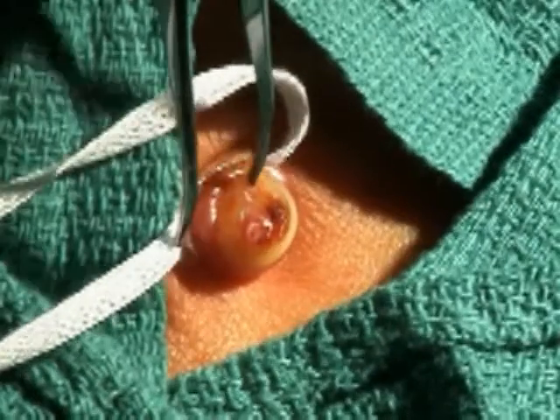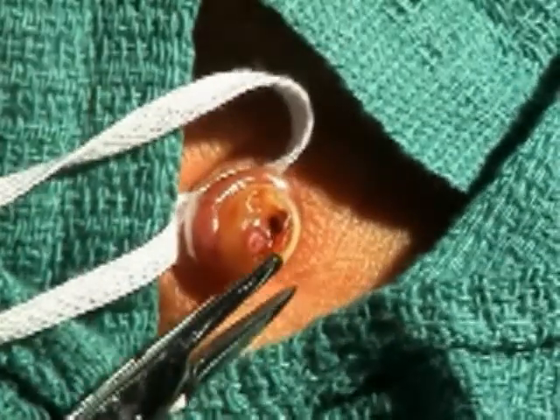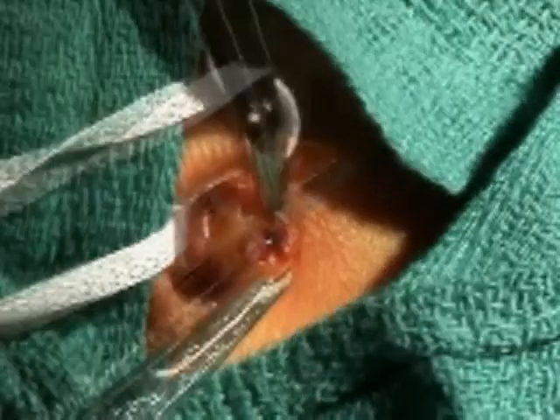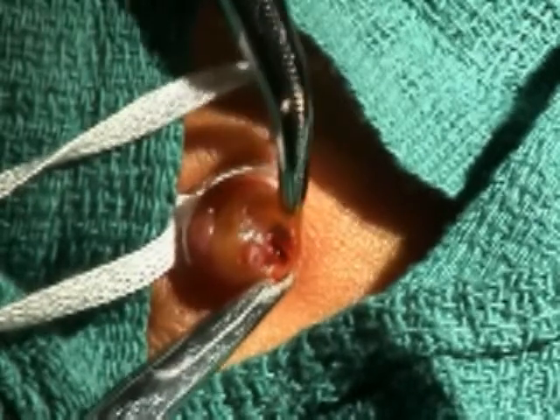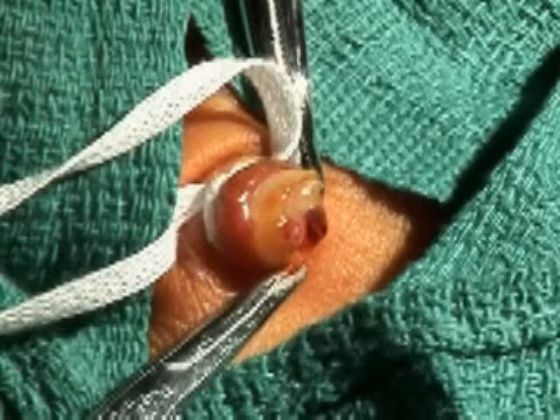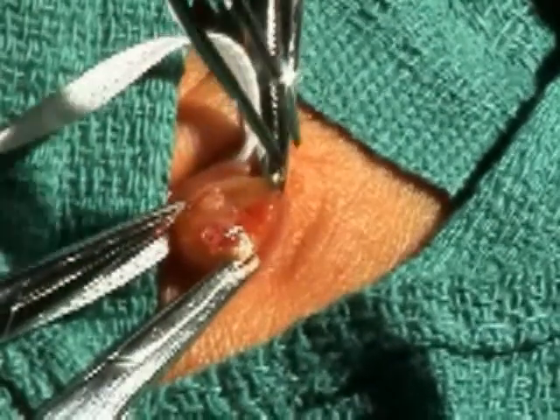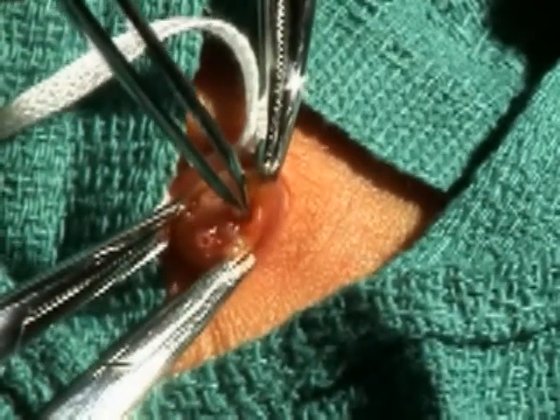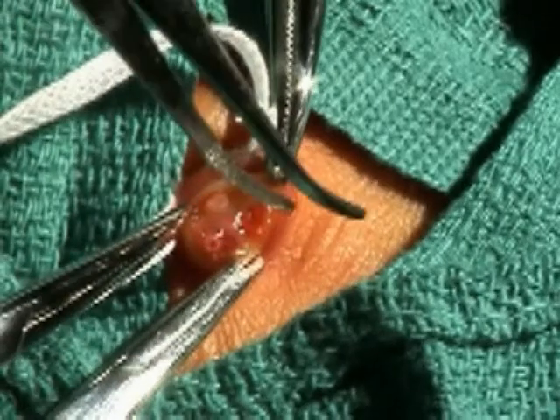The assistant should use the toothed mosquito hemostat to grab the side of the cord near the artery to be cannulated, avoiding grabbing the artery itself. Clamp a curved hemostat to the opposite side of the cord. The assistant should apply traction to these hemostats in opposite directions to stabilize the cord. Using your non-dominant hand, place the closed or pinched tip of the curved iris forceps into the lumen of the artery to a depth of approximately 0.5 centimeters.